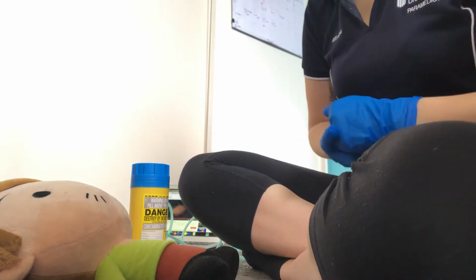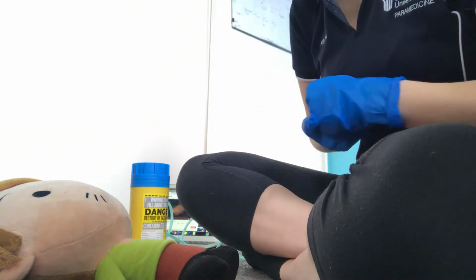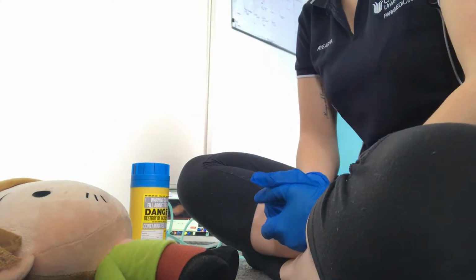So scene is safe. We've already been on scene for quite some time, so we've got our PPE, which is gloves and glasses. The patient is unconscious, so the consent is applied. The patient is postured supine. There is adequate lighting, and we have all our equipment set up.